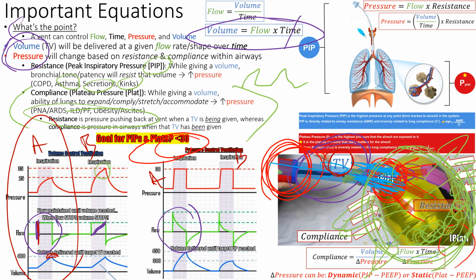Okay? So you can see this patient here, patient B, is sicker in volume control mode. We programmed 400. We gave 400 because that's what we told it to do. But what happened? The pressure went up all the way to 35, right? Because they have an issue with compliance or resistance. We have to do a little maneuver to figure out which one it is. But the pressures rose in the chest because they have a pathology of some sort, right? So that's with volume controlled ventilation.